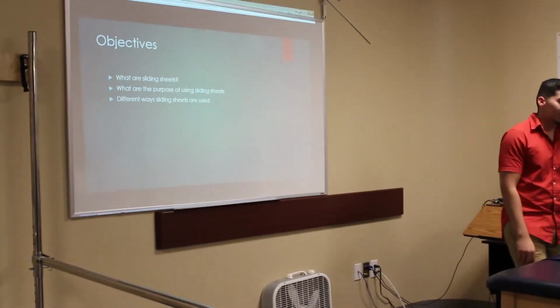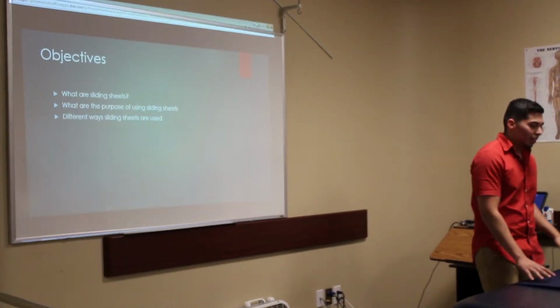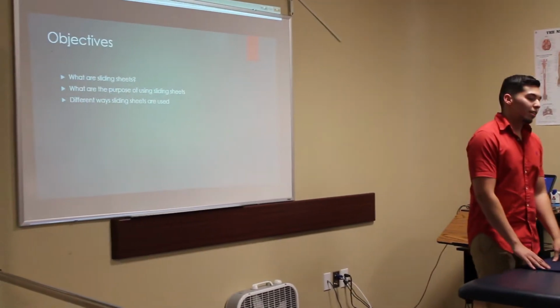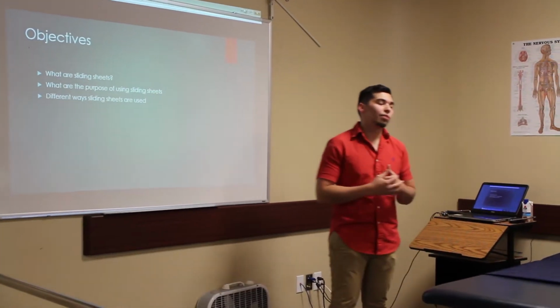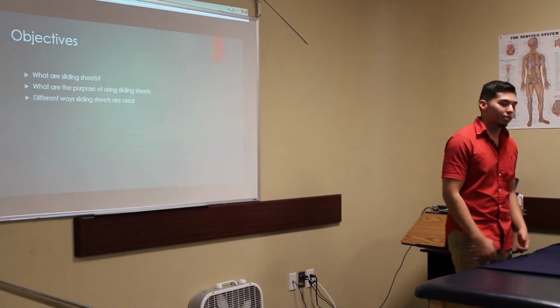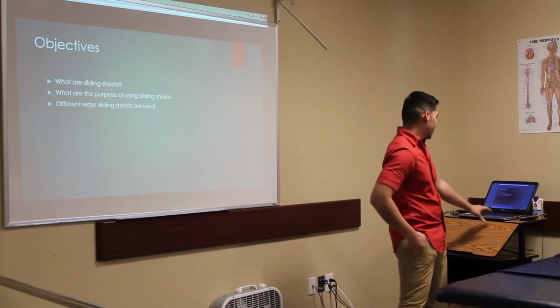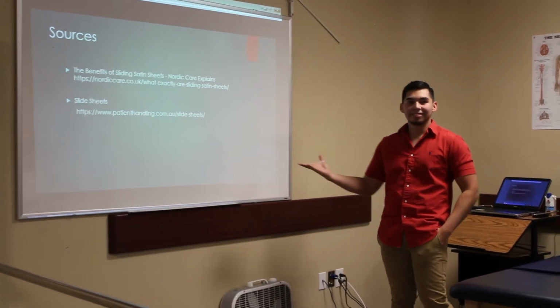No? Okay. In conclusion, what we talked about today was what the sliding sheet is and what the purposes of the sliding sheet are. We talked about sliding sheets being used for bed mobility and transfers, which help not only the patient, but also you, in the sense that you won't hurt your back as often as you would if you had to lift the patient yourself. That's pretty much it, and here are my sources.